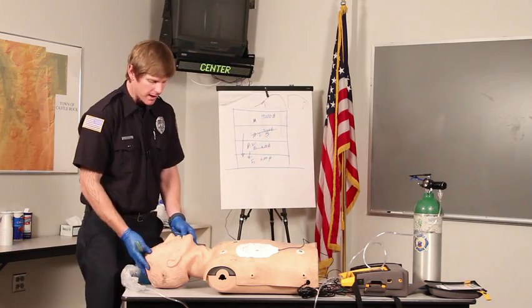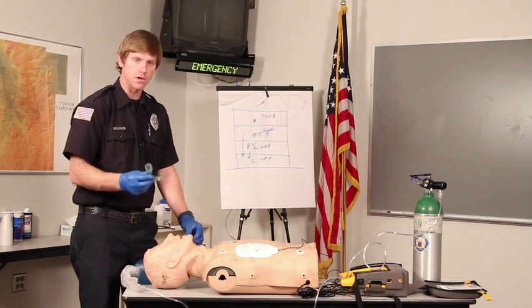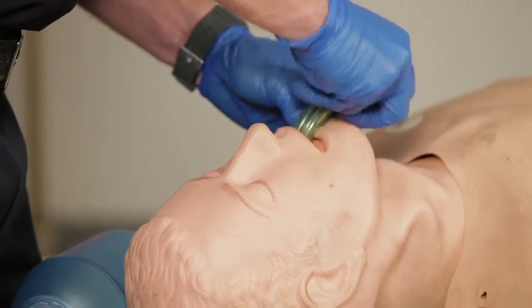You want to make sure and open the airway. You want to use a simple adjunct. You can use an OPA or an NPA. Either one's fine.